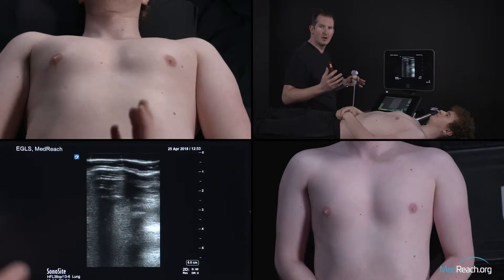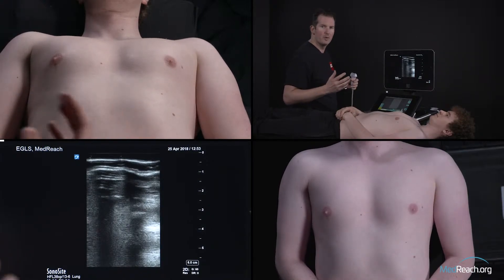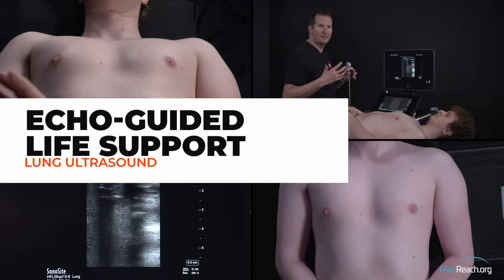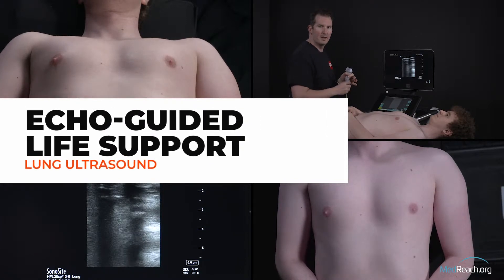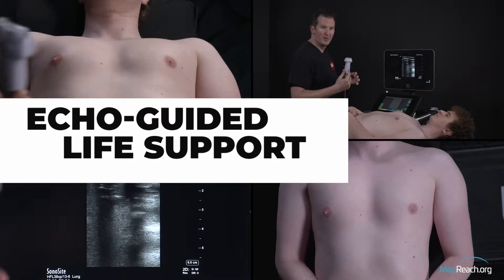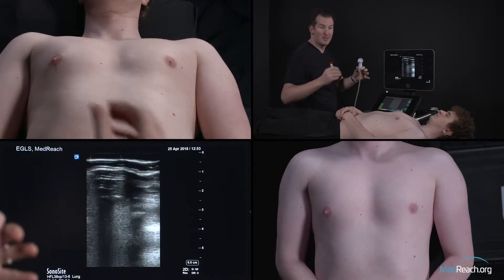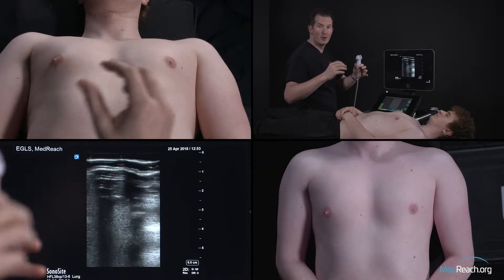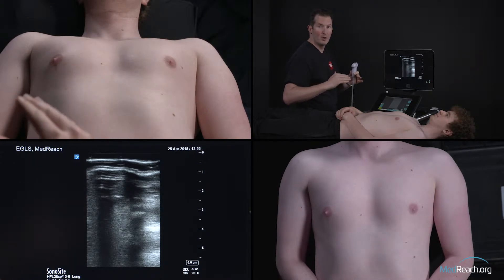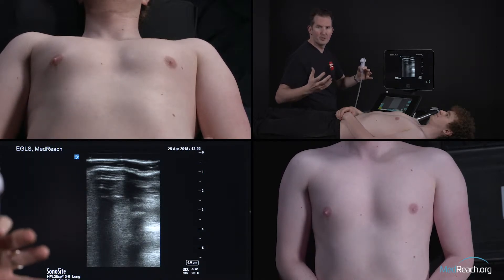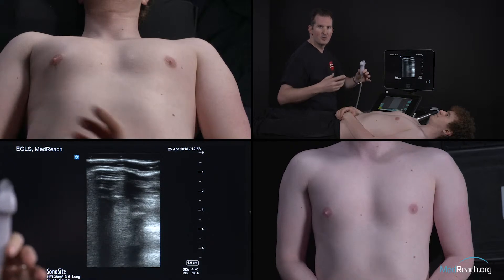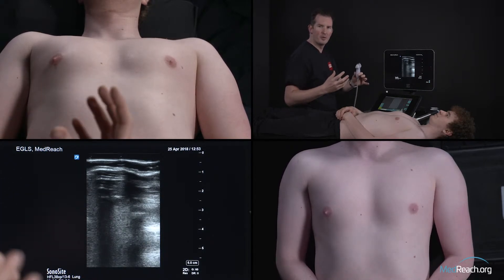To assess the lung, we will first choose a probe that's appropriate for the pathologies we're looking for. We'll start with the linear probe because it's easy to see what's on the screen — you see the ribs, you see the pleura, you have high resolution — but you don't see that deep. So if we were looking for stuff that's deeper, like pneumonias, effusions, or B-lines, we would probably choose another probe.